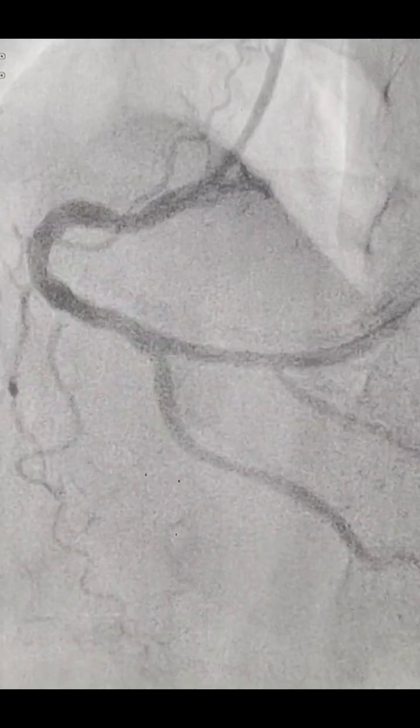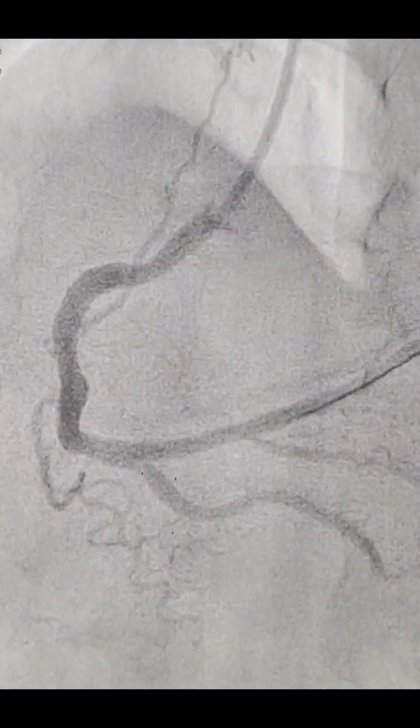So deployed at around 12 atmospheric pressure. This is the scene after deployment. So there was TIMI 3 flow. So I took a plain scene to see whether it was an aneurysm or any thrombus or any bend of the RCA, and you can notice that there is a bend of the RCA. That is why it is looking like that.